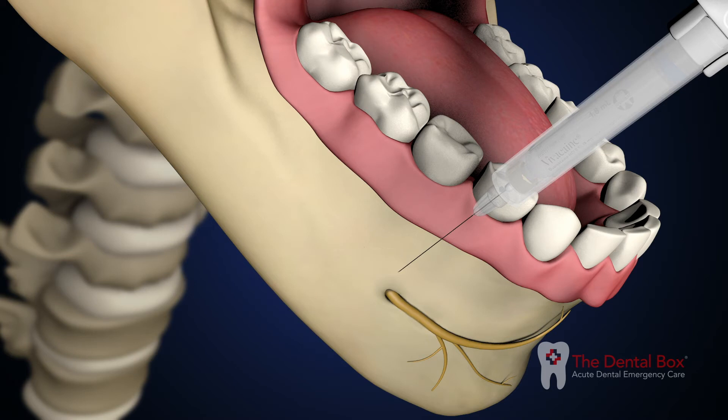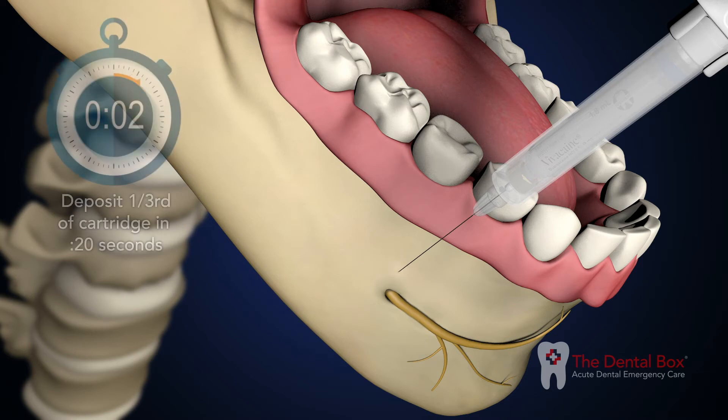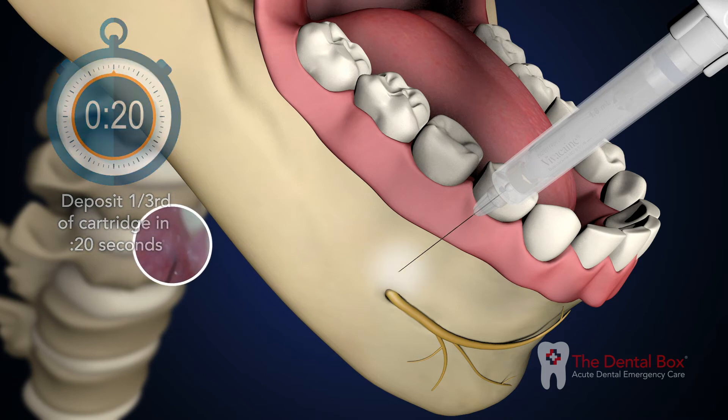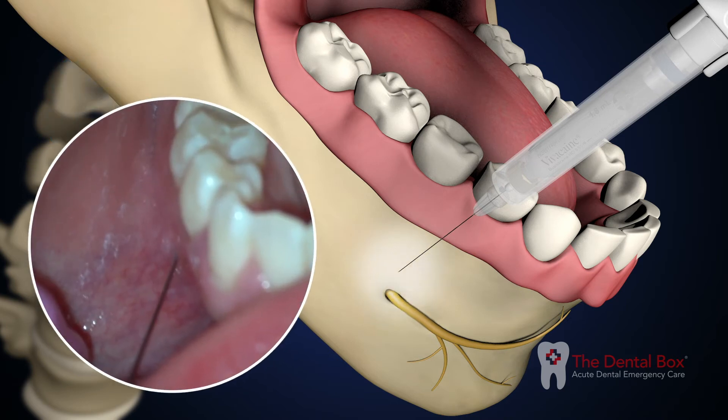Aspirate the syringe. If negative, deposit one-third of a cartridge over 20 seconds. Tissues at the injection site should balloon slightly.